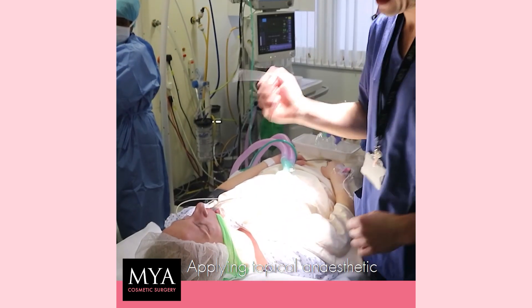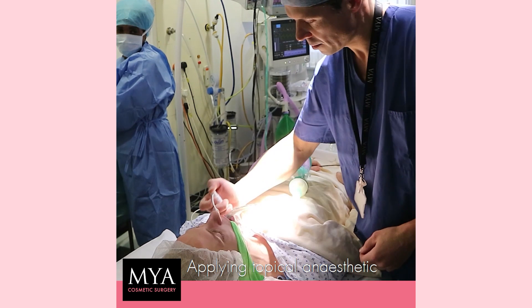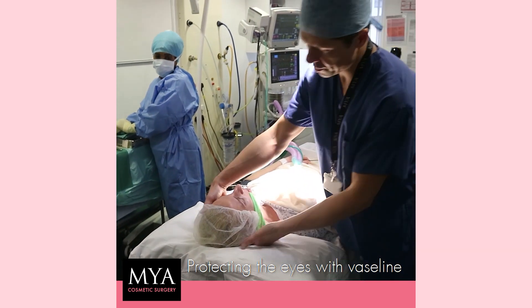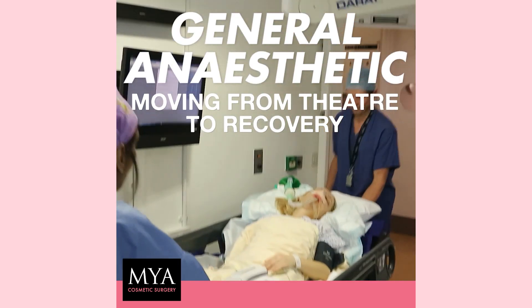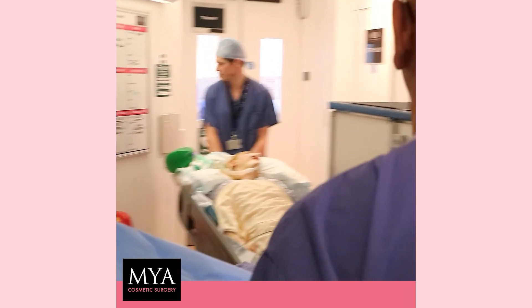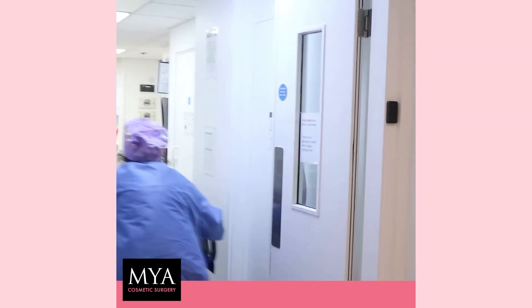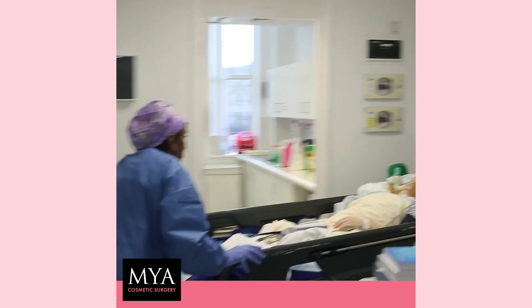This is just a topical anesthetic for the nose. Thank you. And this is just to protect the patient's eyes during the operation.